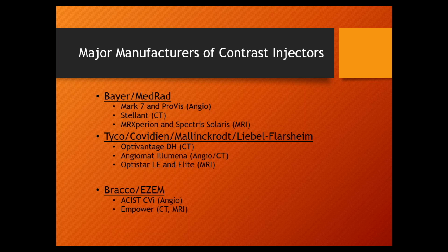Like I said, however, there are a couple of companies that we deal with. When someone goes through our training and they've been trained on how to do the maintenance and repairs on these things, when they go out in the world, they need help, they need parts. There are 3 companies that we always recommend to the students. If you need a part or tech service, tech support, anything like that, check one of these 3 companies. One of them is called IMED. It's out of Texas. They do specialize in the Bracco injectors. They have some service guys who are service trained on Bracco models, and they do have parts and great tech support for the Bracco injectors.